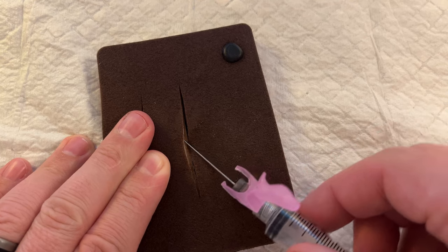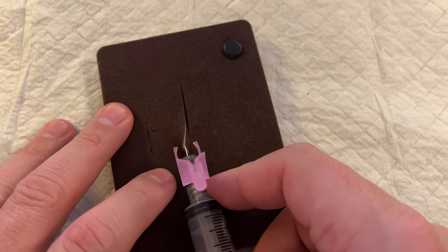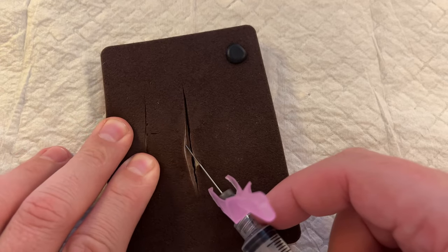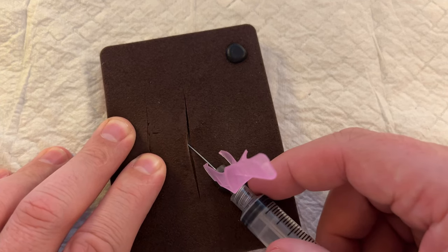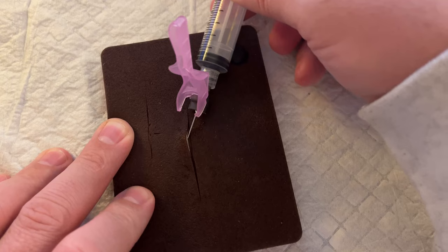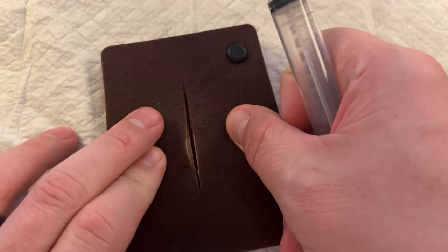To do the fanning method, we want to start in the middle of the laceration, get into the subcutaneous tissue, and go up towards the apex. Once you're there, aspirate by pulling back on the plunger a little bit, making sure you don't have any blood coming into the syringe — which would indicate you're in a large vessel — then inject slowly as you withdraw slowly. As you get to almost where the bevel leaves the subcutaneous tissue, turn the needle, insert a little further, aspirate again, and inject as you withdraw. Do that same technique in a fan-like distribution from the center point of the laceration.